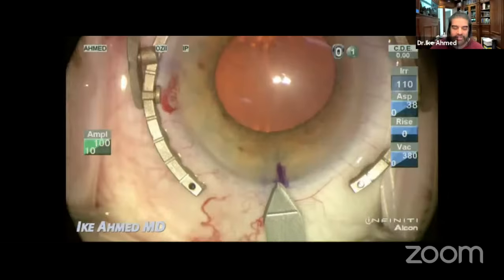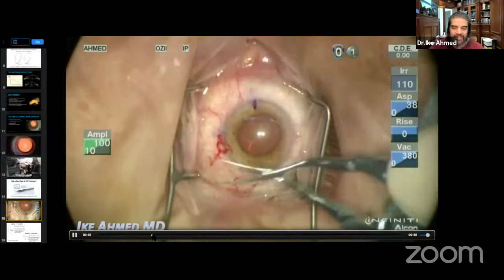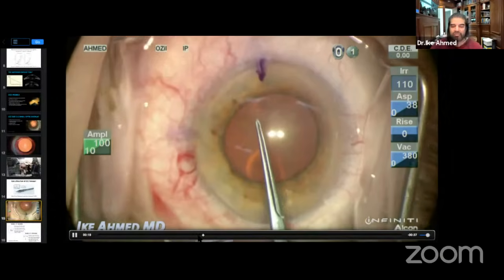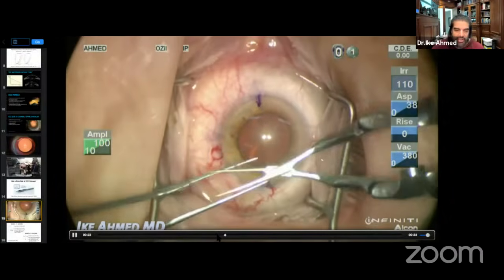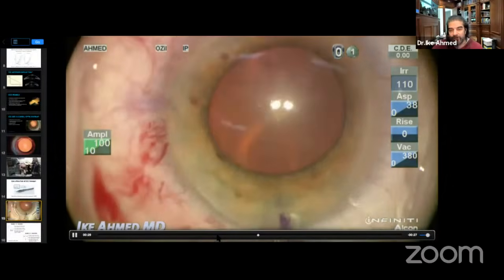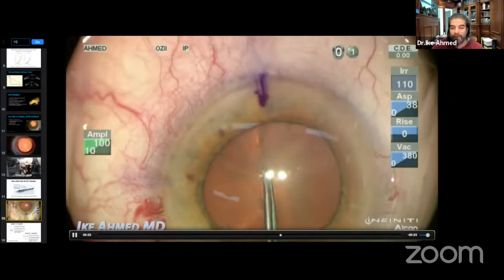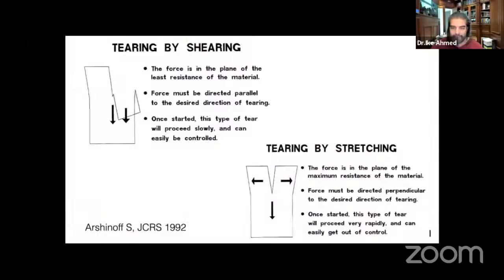And the cross-action forceps have some value, and you can see the difference in these. These can go through a 2mm incision, and they have the advantage of working through smaller spaces and less gaping of the incision. You see the difference with the regular standard capsulorhexis forceps, and the differences are obvious here. So cross-action forceps are helpful, and this is typically what we use. Of course, a microforceps is also very handy for folks to use as well.